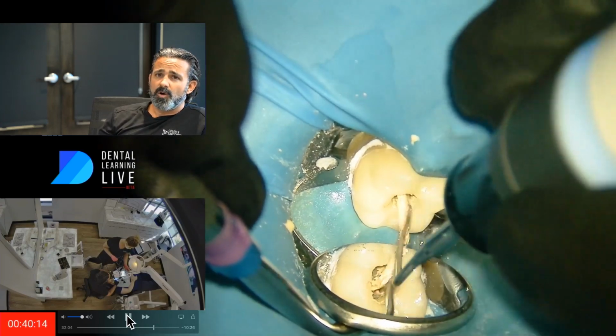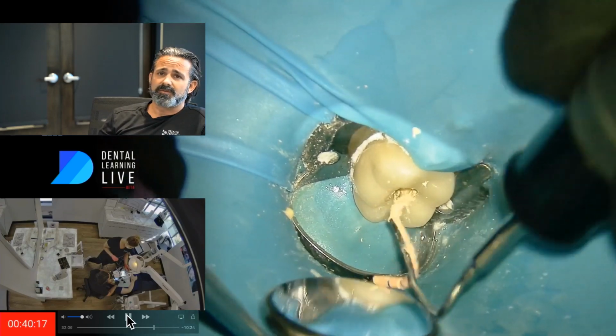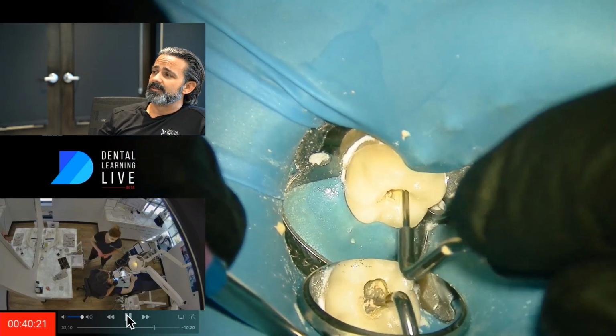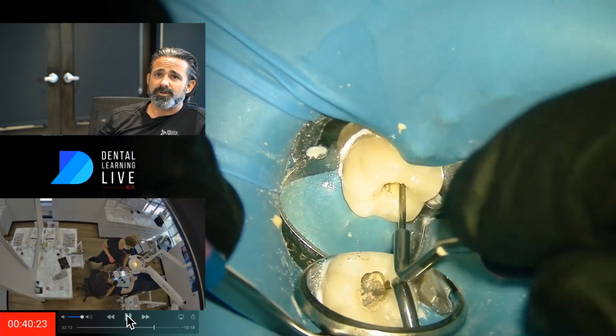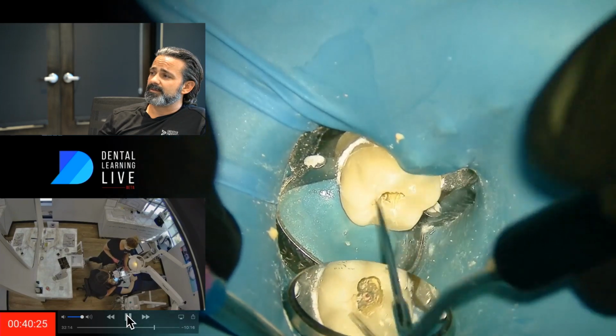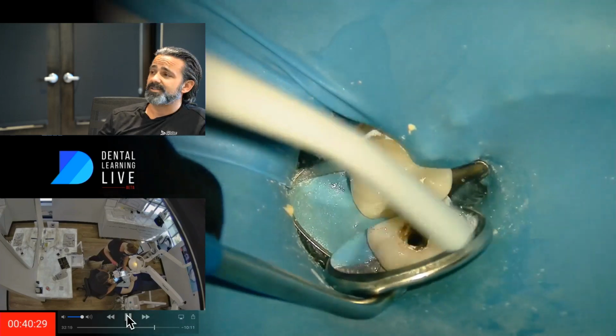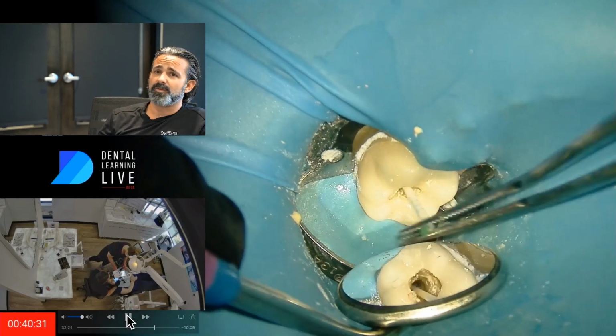So hopefully, by what we just observed, I've opened up an isthmus, but I don't know that yet. I'm just hoping for it, and hoping that I did a better job than the previous guy, and that we found the causative agent and cleaned it up for the patient's benefit.